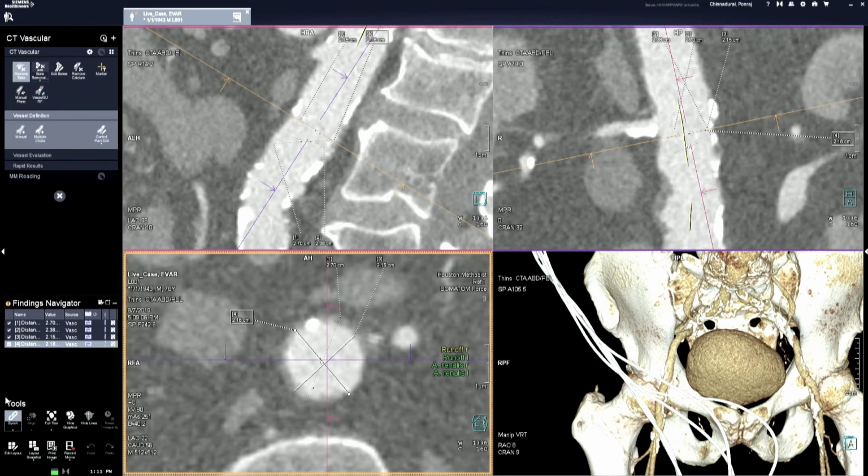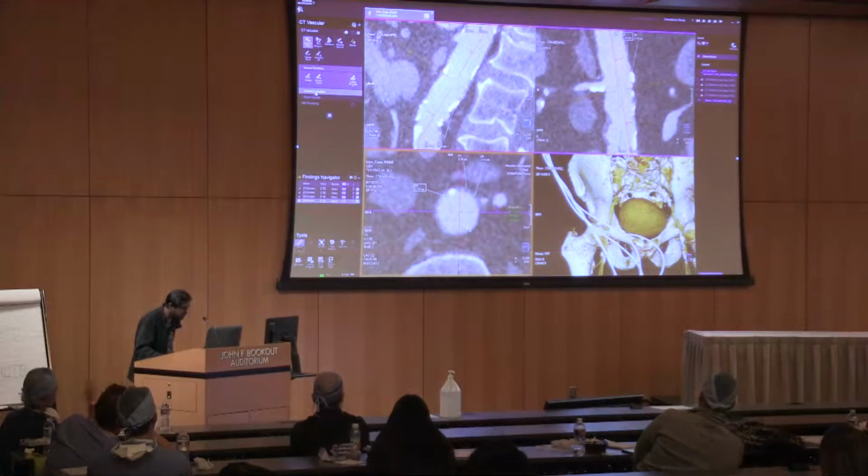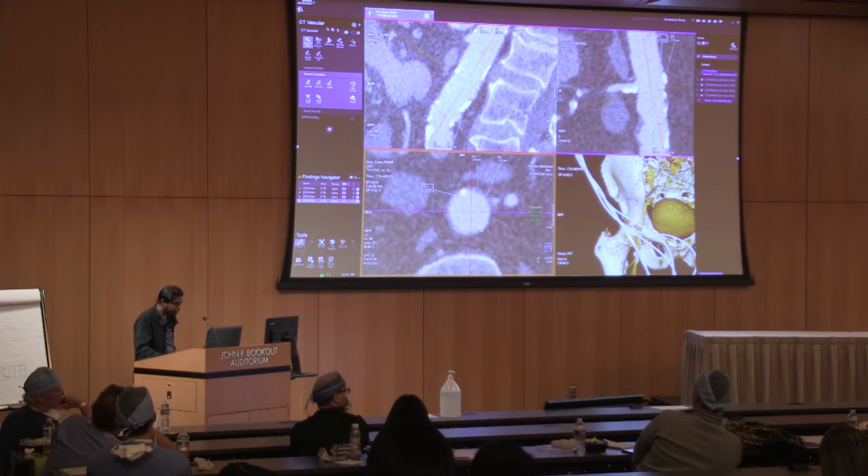Anyone not sold on this technique? Yeah, so why is that better? It's not better than measuring diameters off a centerline reconstruction, right? It'll do the same thing. Yes. If you have a centerline that's corrected properly, you've looked at it, that's also giving you orthogonal views at each point along that center line. So I'll show that here. I'll explain why. Essentially, that's the center line at one plane as opposed to all up and down the vessel.